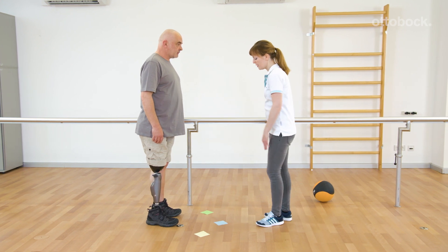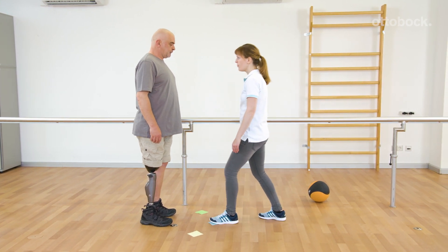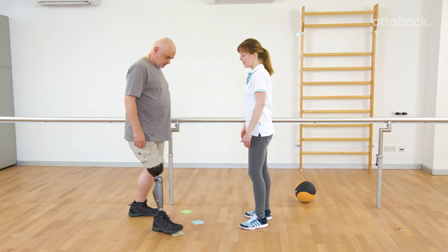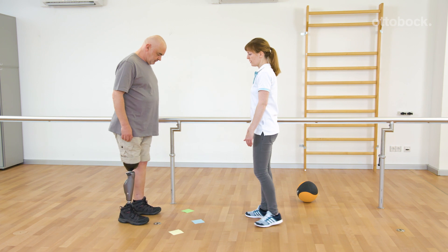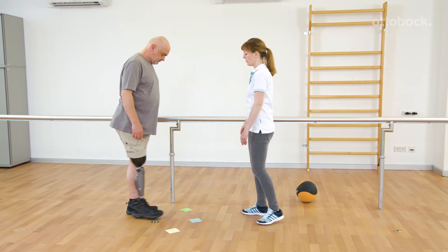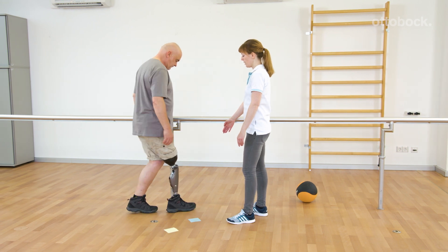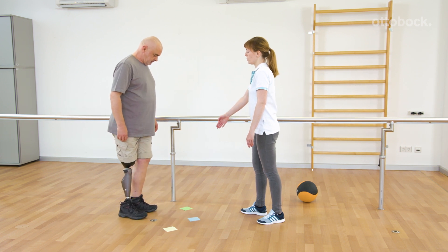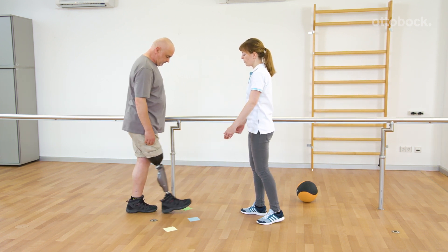Colored ground markings or numbers are necessary for the next exercise. Franziska names the color which Gerhard should hit when he lunges forward. The aim is to yield into knee flexion as far as he is able to control the movement. The intensity of the exercise can be raised by increasing the speed.